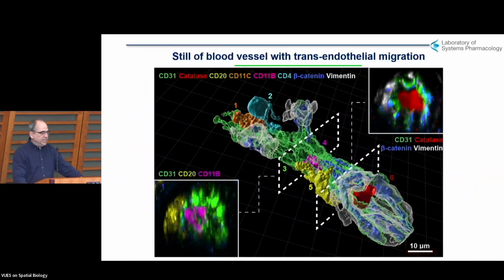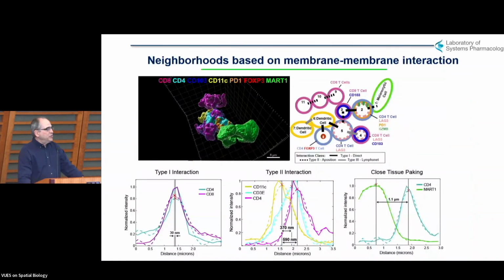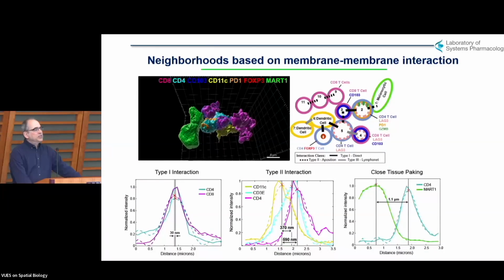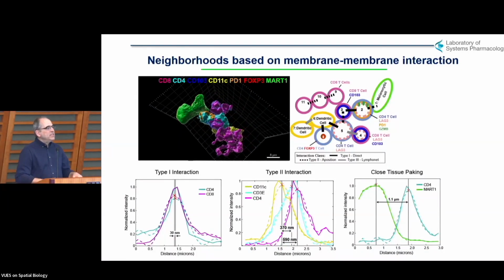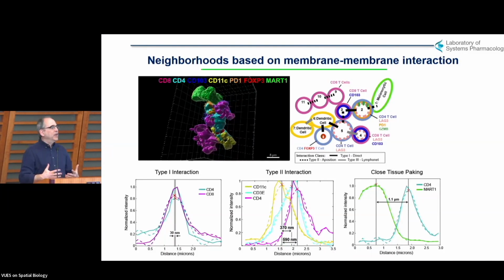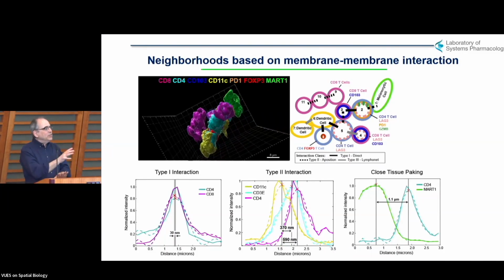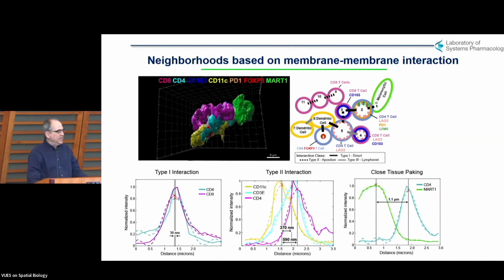Here's just sort of a representation of that, but I won't take you through it in detail. The other thing we're able to do now in 3 dimensions is actually begin to build networks of cells. And so here's sort of a network of cells. And one of the things we've realized in this kind of 3-dimensional data set is that we're missing most of the cellular interactions that are visible in a tissue when we go to 2D, because we've chopped whole sections of a single cell apart. It's not just that we didn't see multicellular layers. We're not even seeing what's happening in a single cell.